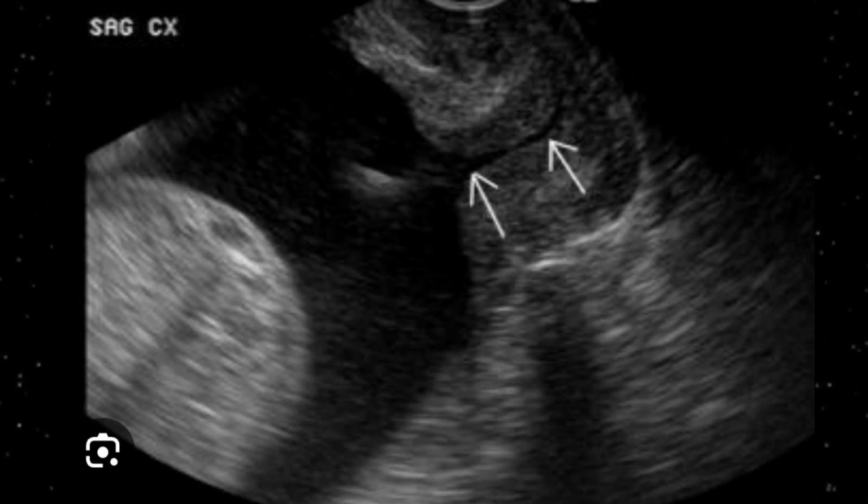This internal os is dilated, so this dilatation can be shown. Besides this, small streaks of amniotic fluid have gravitated towards the endocervical canal, which is shown by another arrow. One more point you can immediately pick is that cervical length is markedly reduced. I think it is even less than 2 centimeters. So this cervical length is quite small, quite narrow, and the width is also markedly reduced, small in size. So this is a particular case of cervical incompetence.